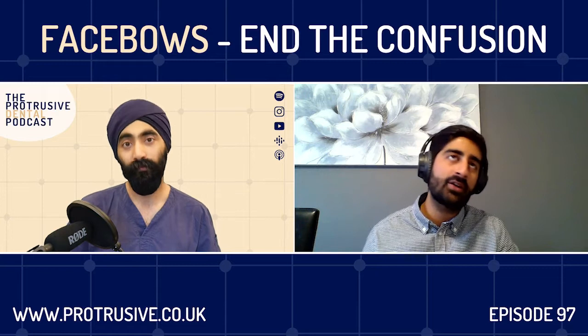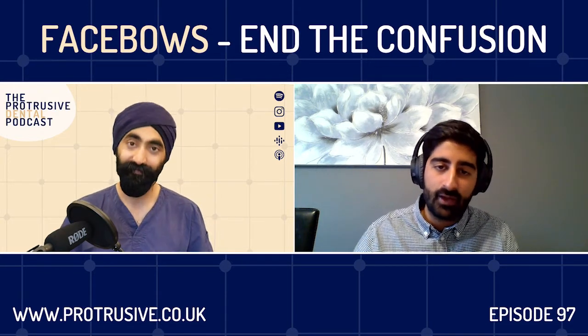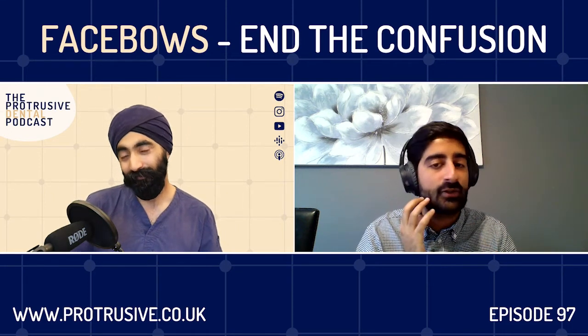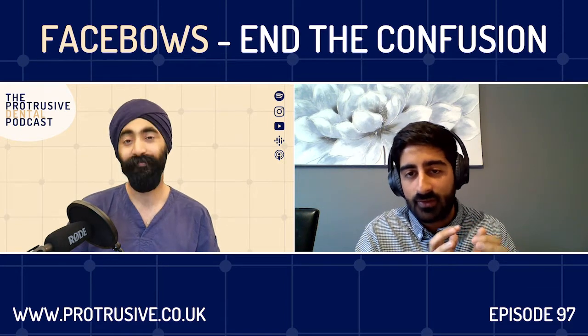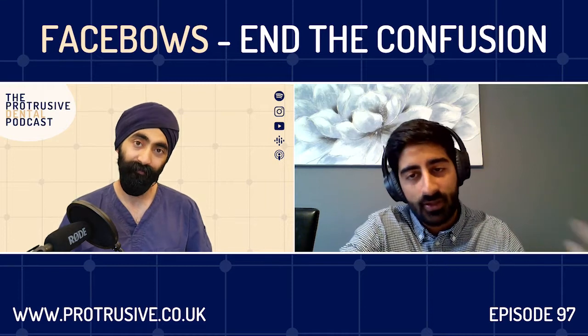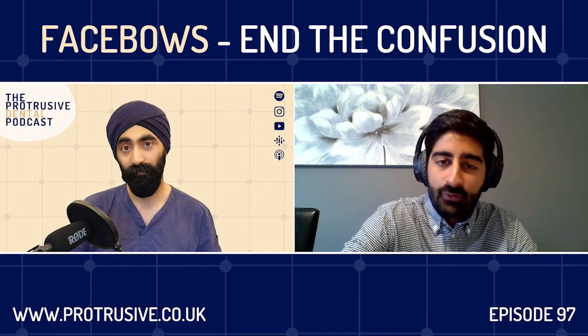And then the last one is if a patient has very, very flat teeth, so 4, 5, 6, 7 are all ground down and very flat. I can just ask the technician to do a handheld articulation and make me crowns on 4, 5 and 6, but when he moves, everything will turn out flat at the end because he'll just be copying what was there before. And if I want to create nice cuspal fossa relationships which should give stable intercuspal positions, then I need to give the technician a bit more information.